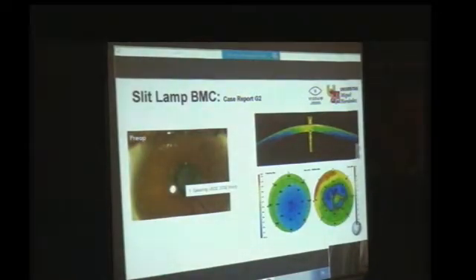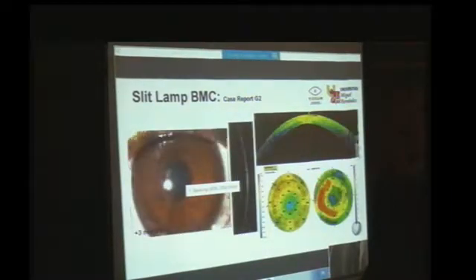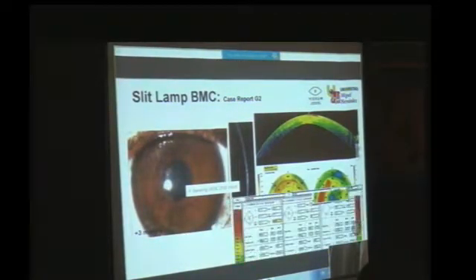But look here how from the pre-op to the post-op we had, at 1 day and 6 months, a clear cornea. In these 6 months you can see it like a contact lens, but it's an intrastromal corneal lamina with no cells, a clear cornea. And you see in the OCT that this clear cornea is creating an increase in the thickness, and in biomicroscopy you see that we have no opacity at the visual axis. Look here as well how we have increased this cornea to 600 microns thanks to that addition in the tissue that we have. And remember, these corneal laminas were with no cells.